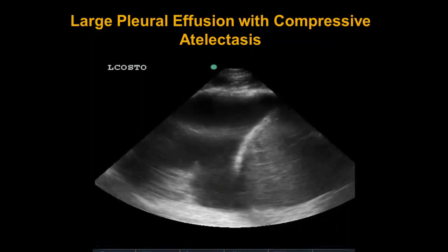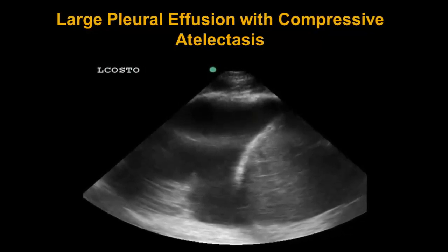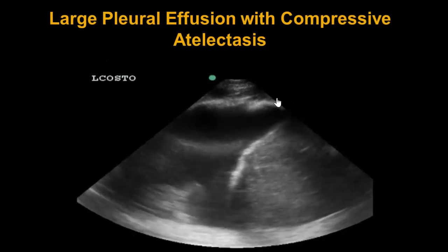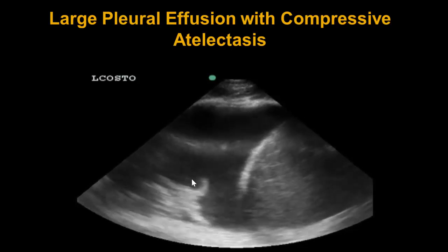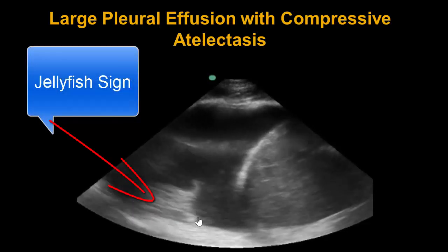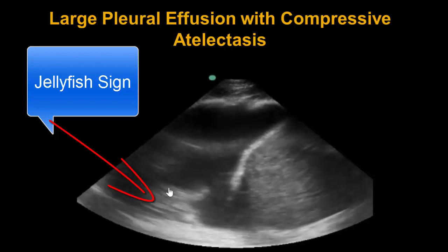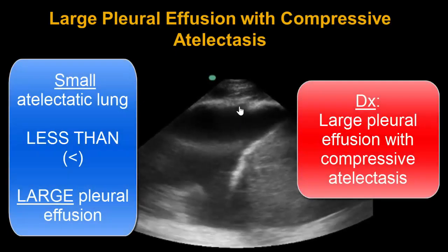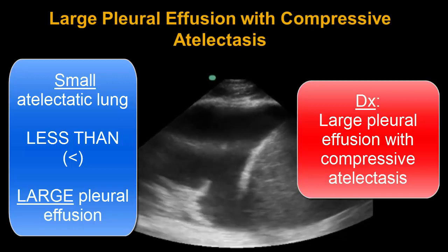So far, we have seen a couple of nice examples of secondary pleural effusions due to a primary lung pathology such as pneumonia. Now let's take a look at secondary lung consolidation — otherwise known as compressive atelectasis — in the setting of a large pleural effusion. In this image, we are seeing a left costophrenic view. As I activate the video, again we see chest wall, diaphragm, spleen, a large anechoic space with atelectatic lung, and the jellyfish sign, which looks like a wagging tail and represents the distal segment of atelectatic lung. In this case, we see quite a large pleural effusion compared to a small compressed atelectatic lung. Therefore, the diagnosis is a large pleural effusion with secondary compressive atelectasis.